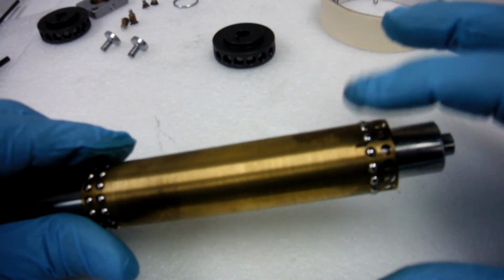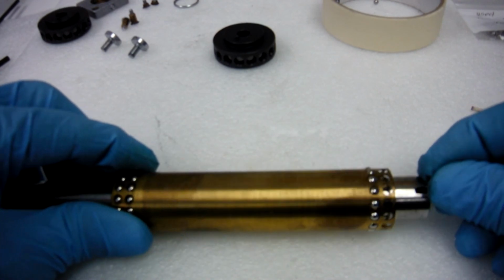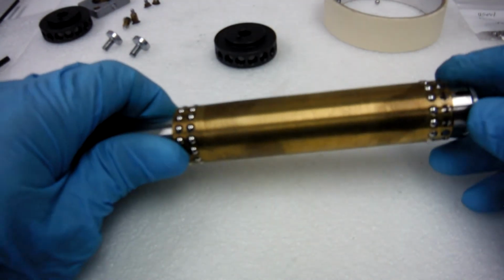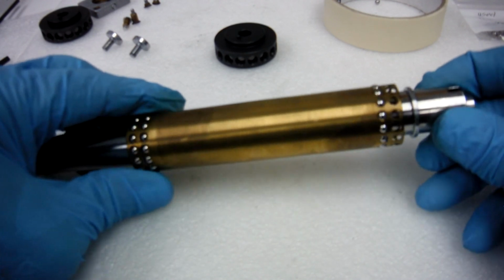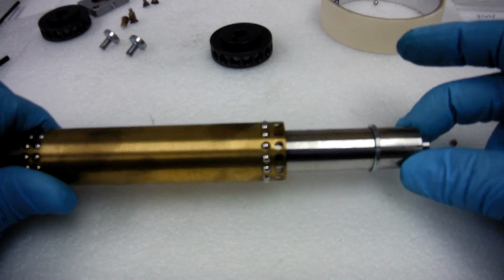Okay. We have our first row, second row the same way. We just put one in, go all the way around, and you'd get it. Once you have it, put your ring back on so that you don't lose them again. I think you can do it.